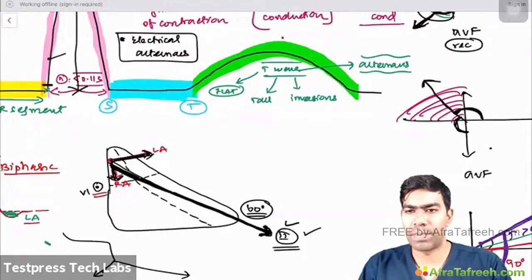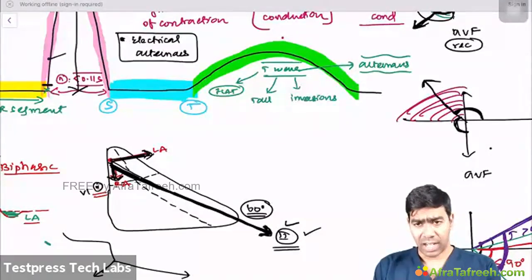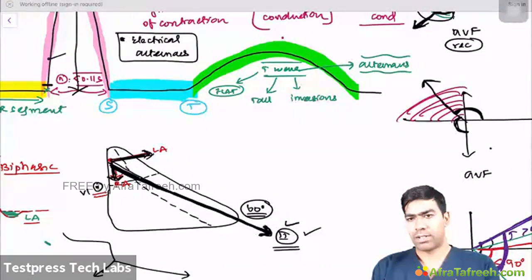How to differentiate a P wave under a T wave normally? This is a very basic question from every beginner. I think you must not be so well versed about these days. That's why. Remember, again, the same electrophysiological rule applies. If a wave is originating from one particular area, and consistently originating from that area, it will have the same morphology. So it's the morphology that will differentiate. Basically, you cannot really differentiate just by seeing. The morphology is what will tell you.